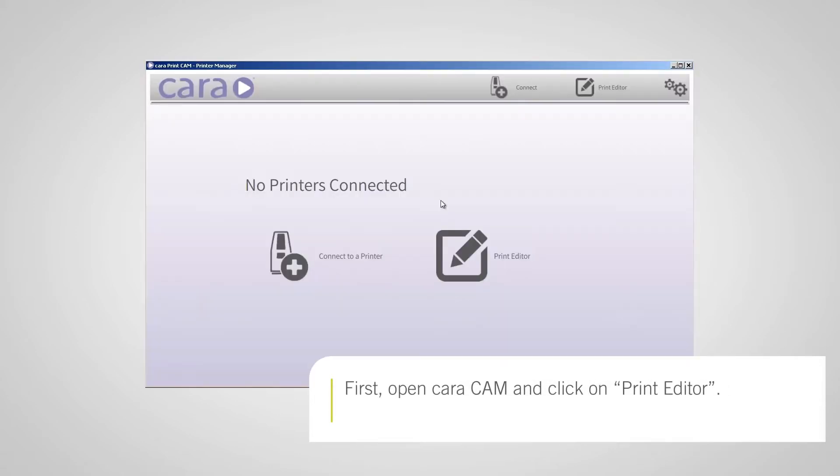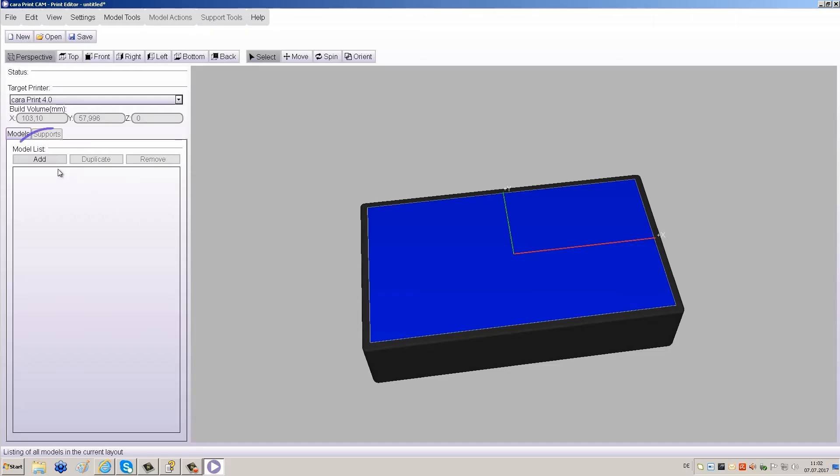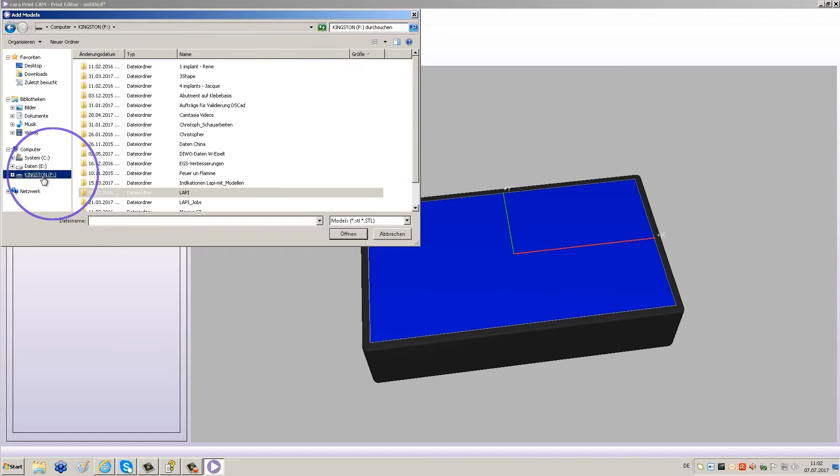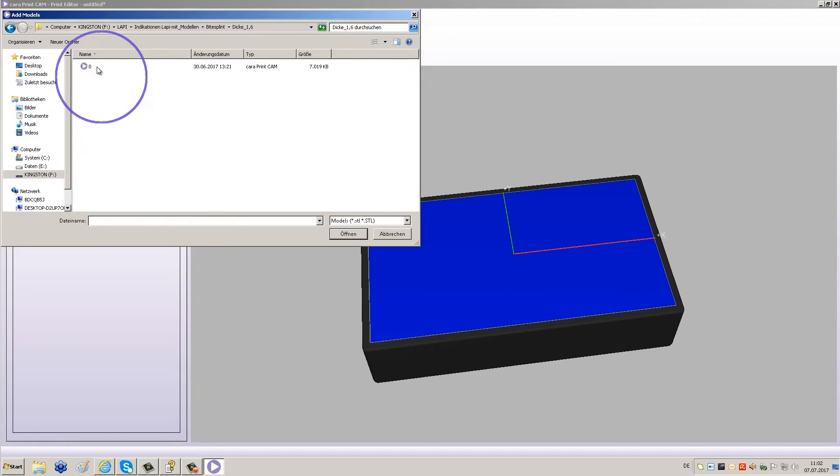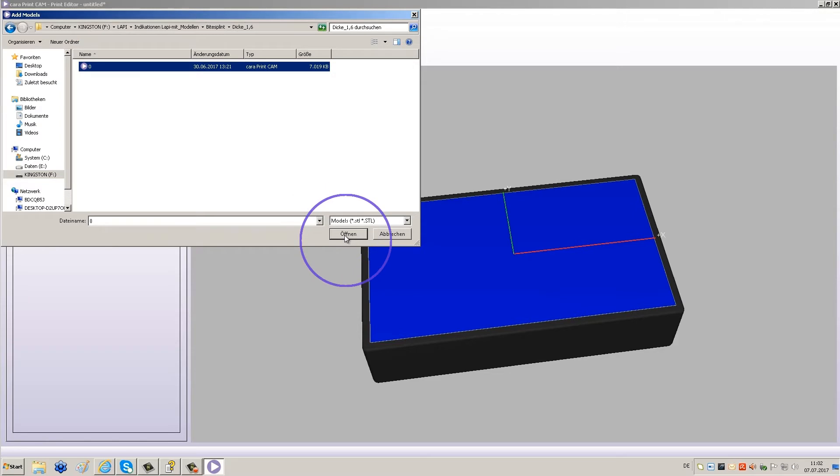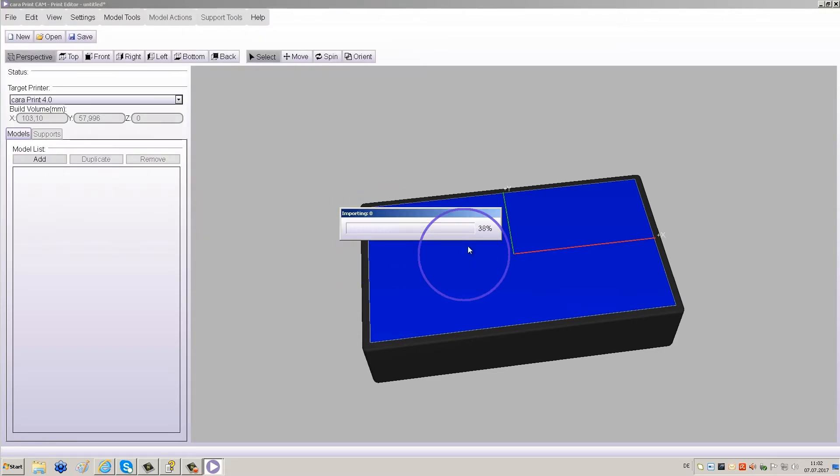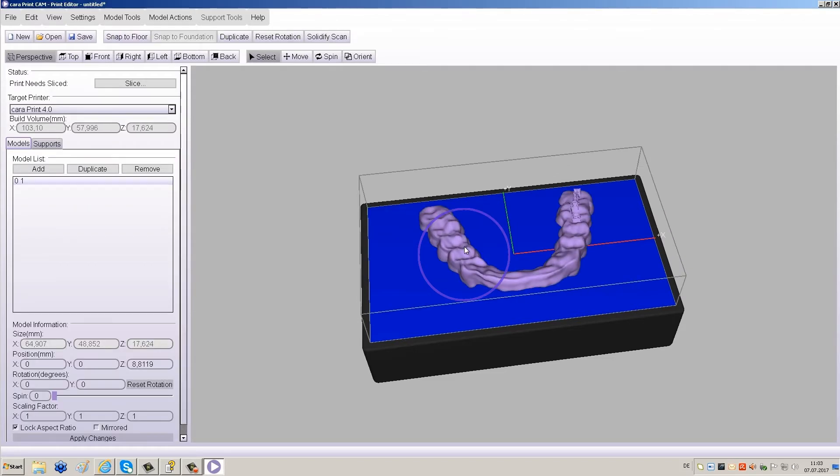Start by opening CaraCam and click on Print Editor. Under Model List, click Add. Locate the STL file that you wish to print and click Open. A pop-up window will ask you to select the STL units and then the file will be imported.